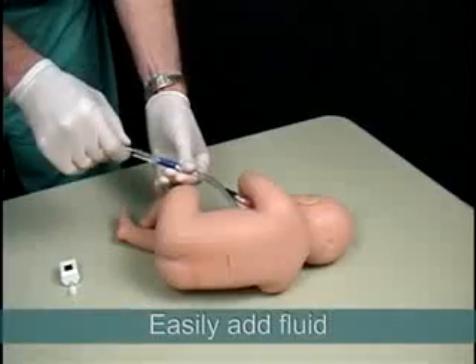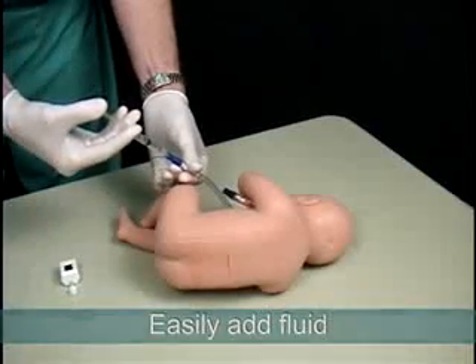If fluid levels become low, they can be easily refilled using water or the included red fluid.